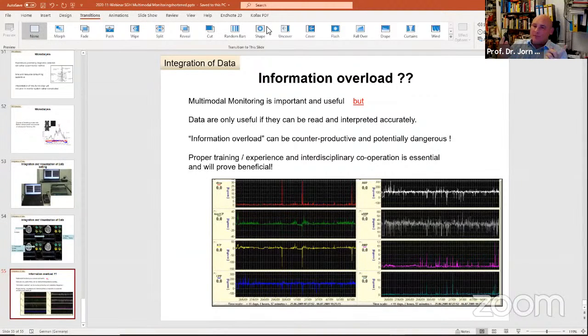And second, I like separate probes, because sometimes you have a PO2 probe that doesn't work or that you have to replace. And that goes to your second question: if an ICP probe is in an infarct or a lesion, and you haven't done any operation before, you still measure the ICP relatively accurately. But the PO2 is useless. So I usually use separate probes and put the PO2 probe according to the CT scan, where I can actually get some useful information. You can also change them around. If one is broken or has to be replaced, it's easier to do with small, single probes. And it's cheaper in the end, because you don't always need all the probes, so it's better.